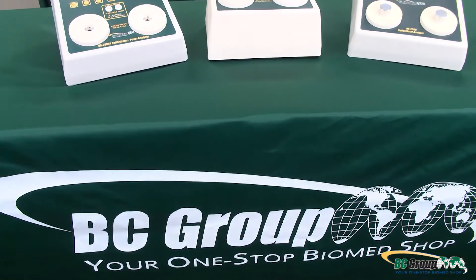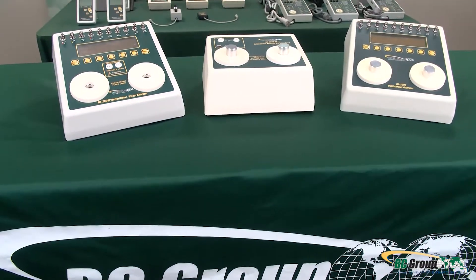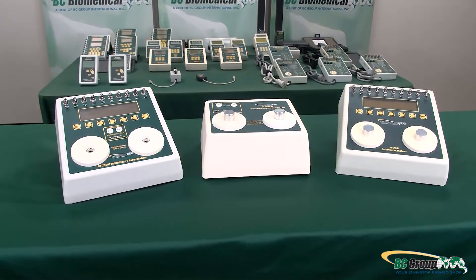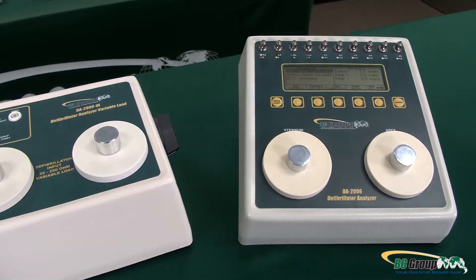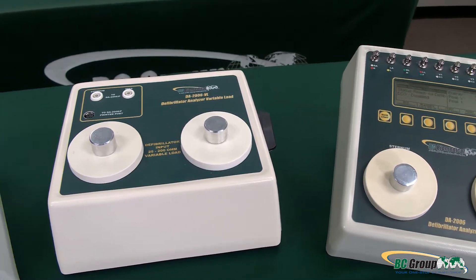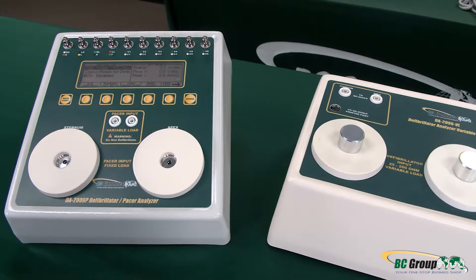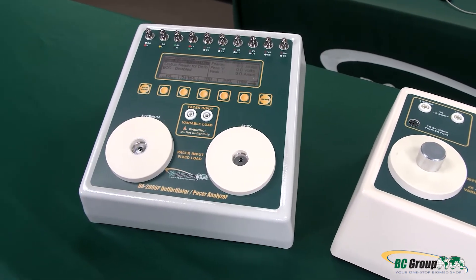If you're on the lookout for a new defibrillator analyzer and AED tester, then BC Group has your answer. Our options even make sure you don't pay for more than what you need. BC Group has two models to choose from, with the option to include a variable load module for advanced compliance.